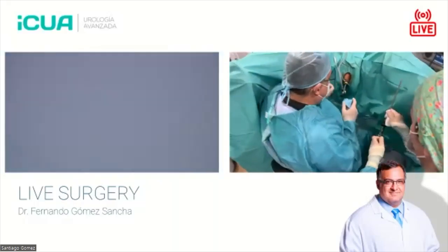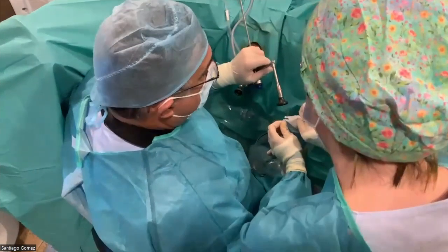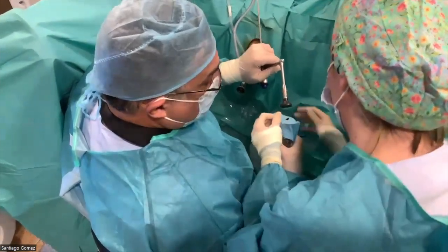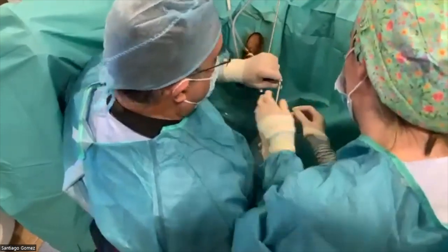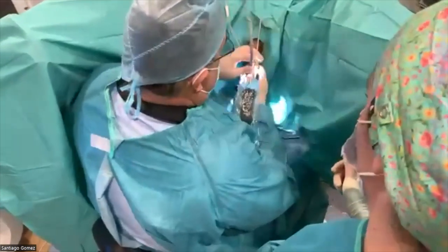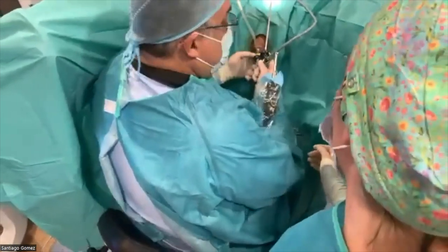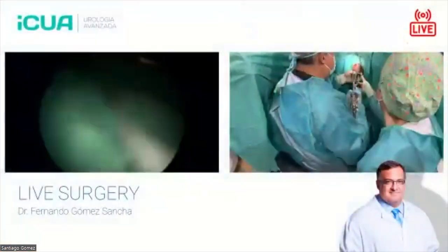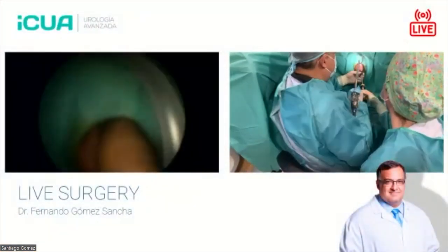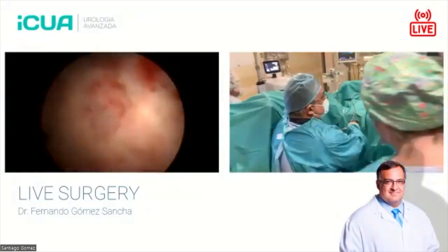I like very much the Otis urethrotomy. I don't do it systematically, but if I notice some difficulty entering with the scope, I do an Otis urethrotomy, a very mild, very gentle Otis, because I think that reduces the chance of ischemia of the urethra during the operation and posterior stricture.